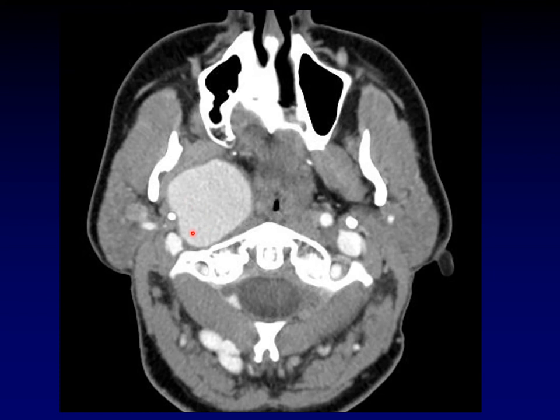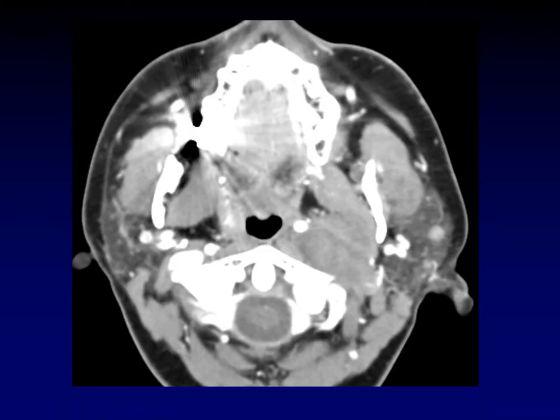Here's an example of a pseudoaneurysm. Look how it's displacing the parapharyngeal fat predominantly anteriorly and a little bit medially — that medial displacement tells us it came from the post-styloid parapharyngeal space rather than the retropharyngeal space. Also, there is no carotid artery visible; this is all one big pseudoaneurysm. Here's an example of a nerve sheath tumor — a neurofibroma — again displacing the parapharyngeal fat predominantly anteriorly and a little bit medially. This is a post-styloid mass.